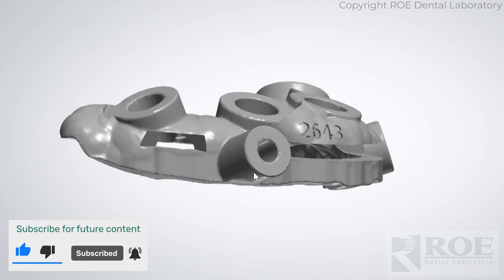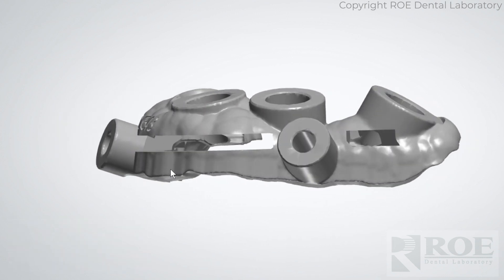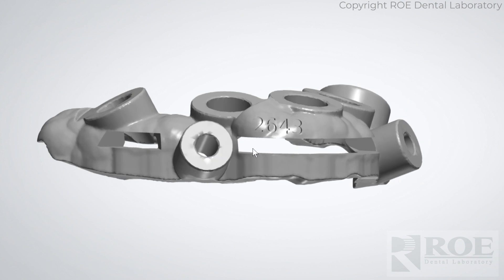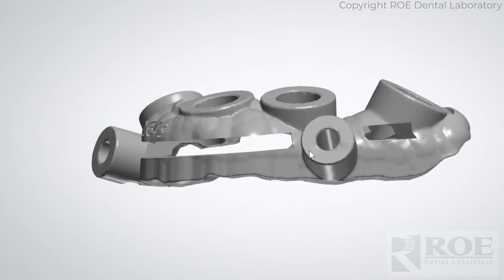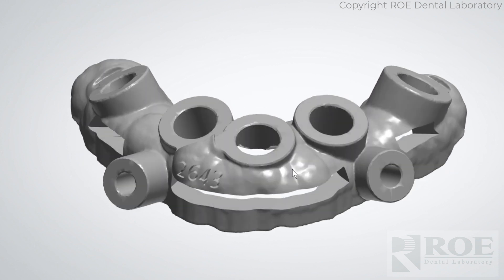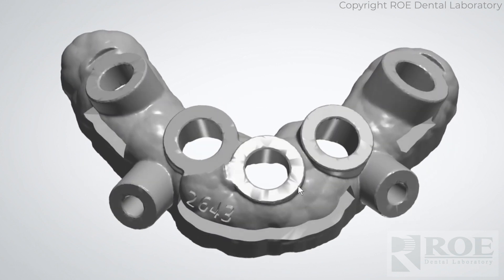It has a channel that you can see here, designed digitally through the facial. This is where the bone is scored to give a reference of where the bone should be reduced. It is anchored with these fixation sites and it is also an osteotomy guide.